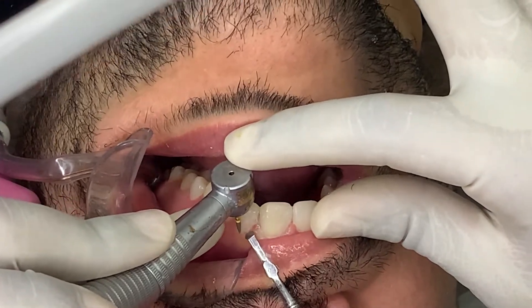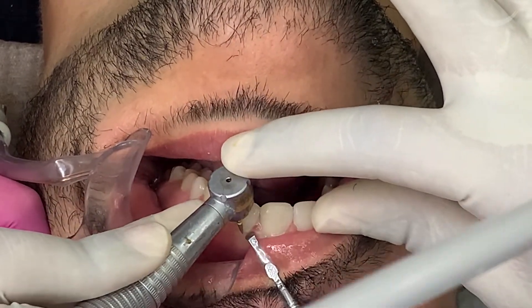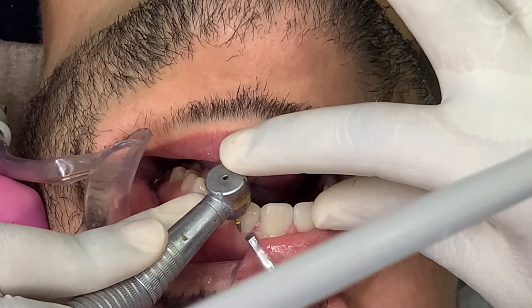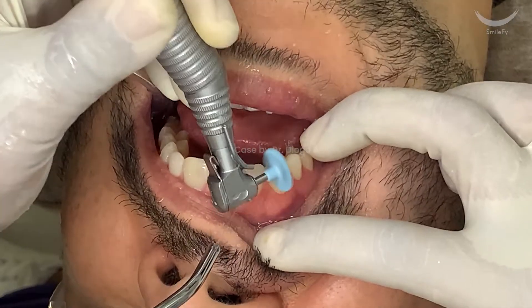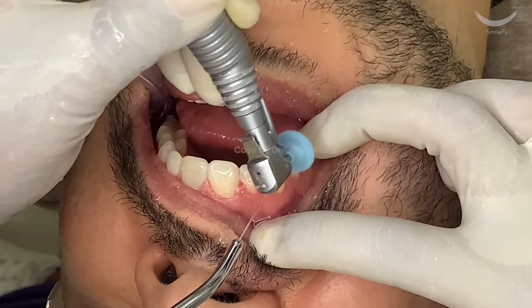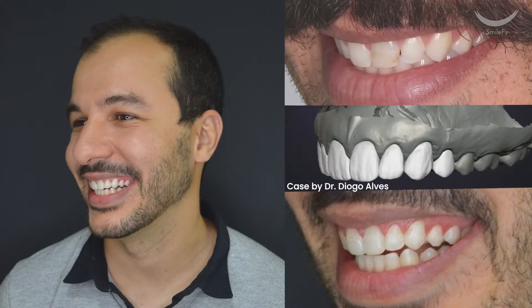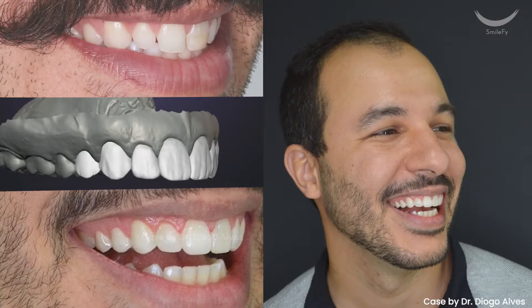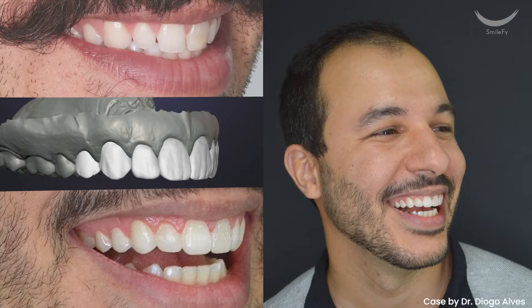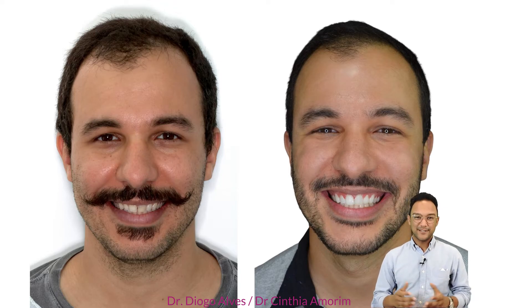A cylinder round bur was used to inspect not only the emergence profile, but also the interface for marginal integrity during gingival retraction, in order to give a more natural and anatomic facial contour of the buccal surface. All teeth were properly polished to increase the longevity of the final restorations. No adjustments were made to the buccal anatomy — only small polishing and finishing. The occlusal bite and guidelines were then checked to ensure the final results were functional, harmonic, and aesthetically pleasing. This case was done in only two consultations using the Smilefy platform.